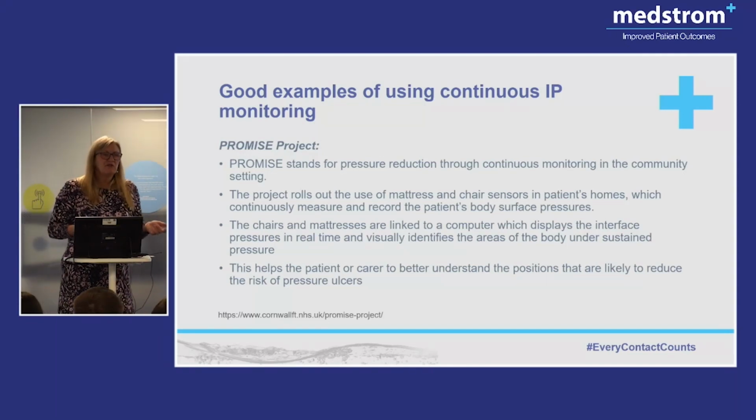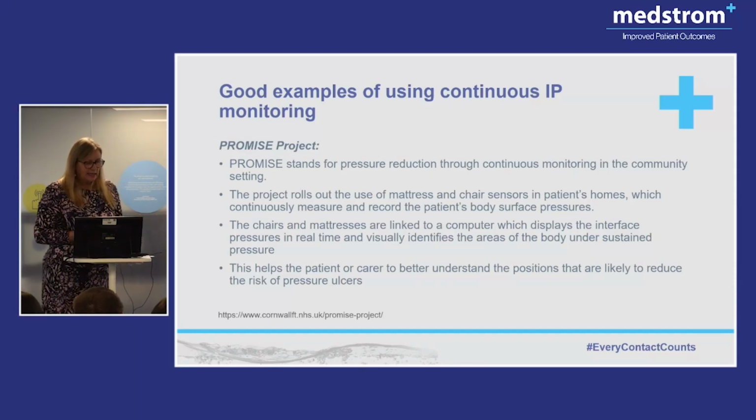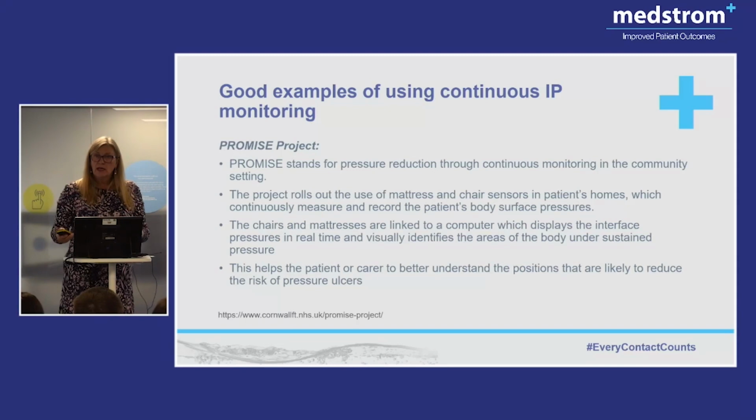And lots of them said, I don't understand why I have to use it. What's the point? What difference does it make to me? So Nikki started to look at how she could work with patients to find the best solution for them. And isn't that what person-centred care is about?